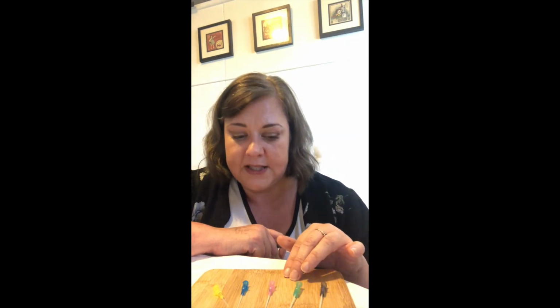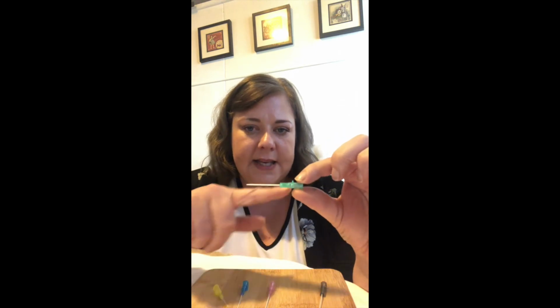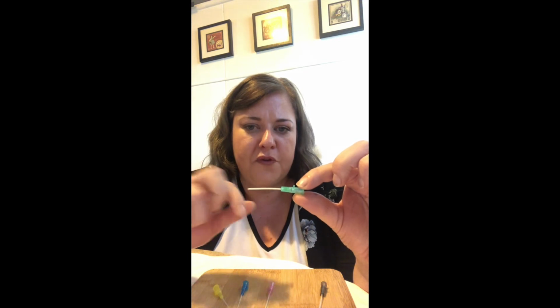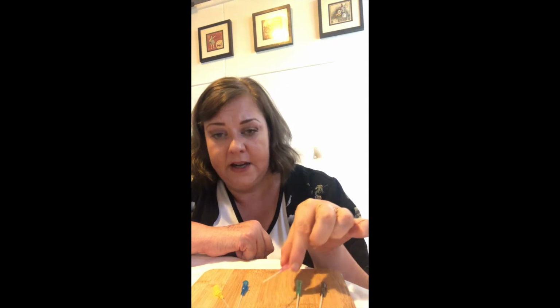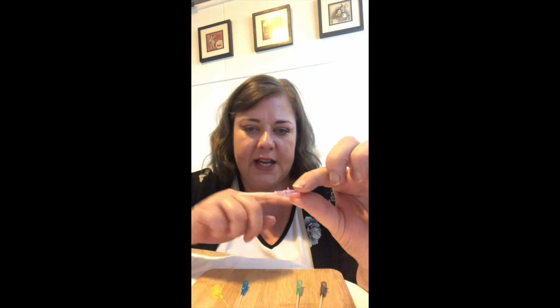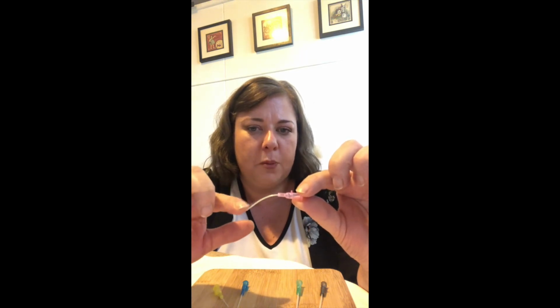So we'll look at all the cannulas we have here. We started with our 16 gauge grey cannula. We'll move down a size and up a number to the 18 gauge green cannula. Now you can see that it's still quite long, it's still quite thick, and it's still fairly rigid. Moving down a size and up a number to the pink 20 gauge cannula, which has still got some length, but you can see it's starting to become more fine, and this is getting a little bit more pliable.